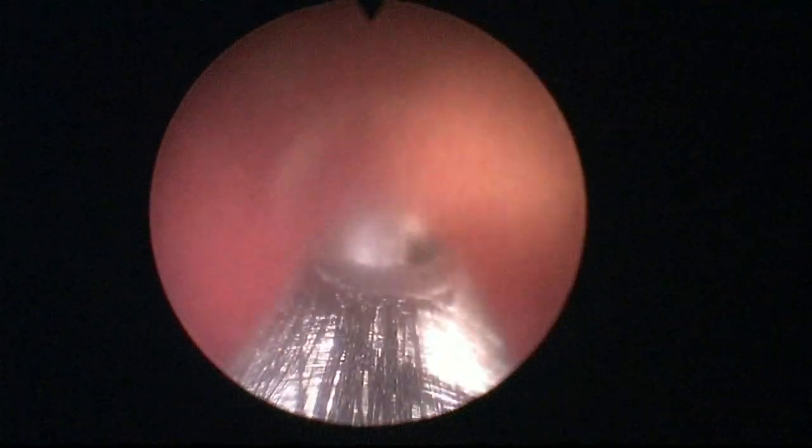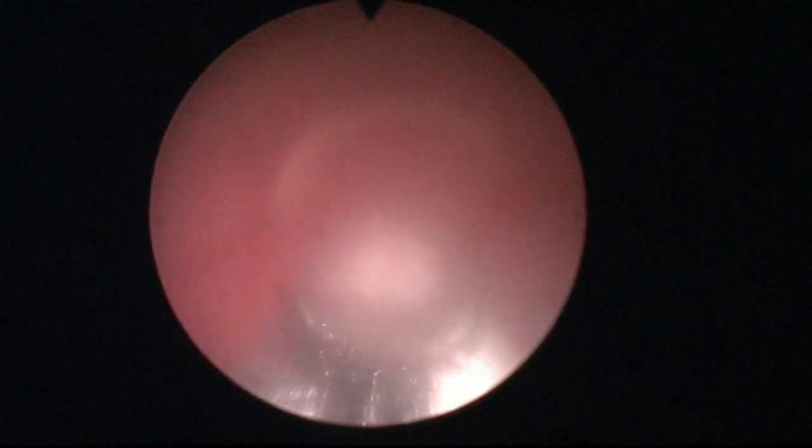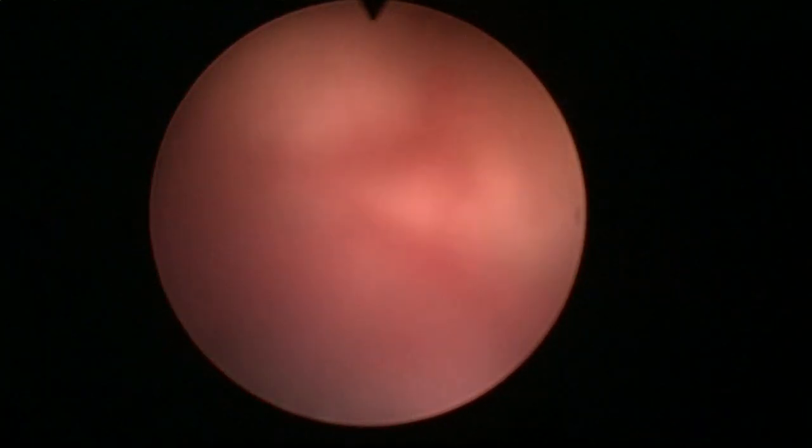Wait a minute, I think I'm going to try to bring it into the fossa. Let's see. Now we are in the fossa, but still not good. Now you see visibility is dropping a little bit. Yeah, so there's still one piece. Let's see if I can find it. It went into the fossa. This is a small clot forming. Here I caught it again.